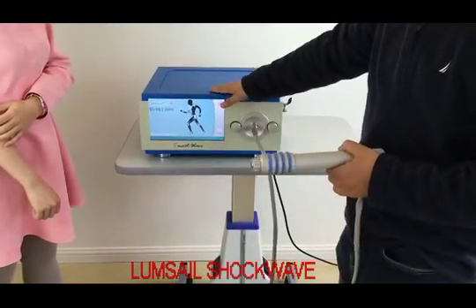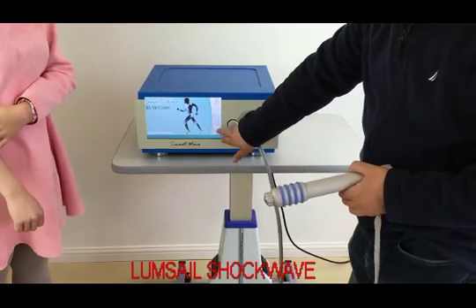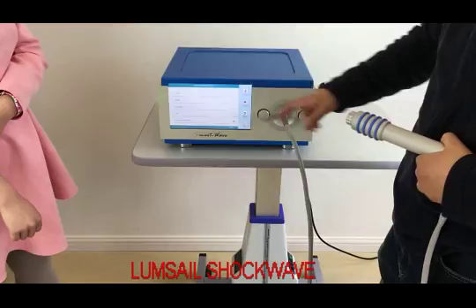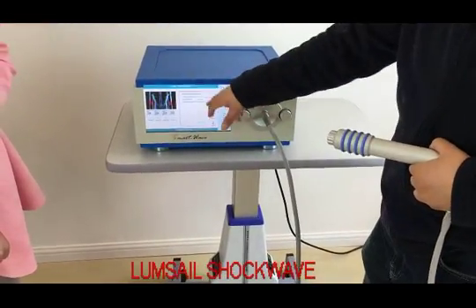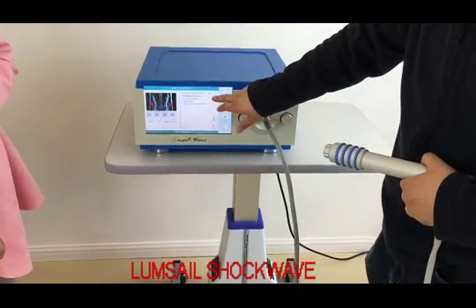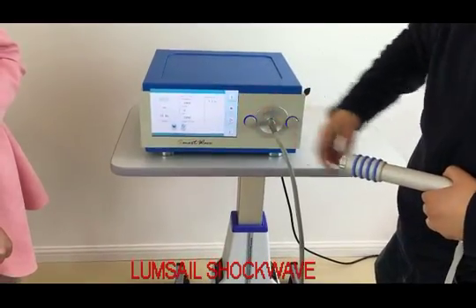After we power the machine, we can see the operating menu. We click the start menu and then we can select different positions on the human body. For example, if we choose elbow, here is a recommended treatment program. Then we click OK button and we enter the treatment menu.